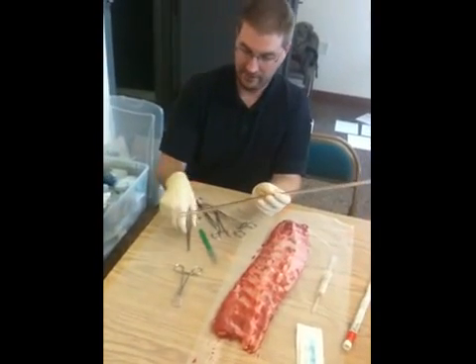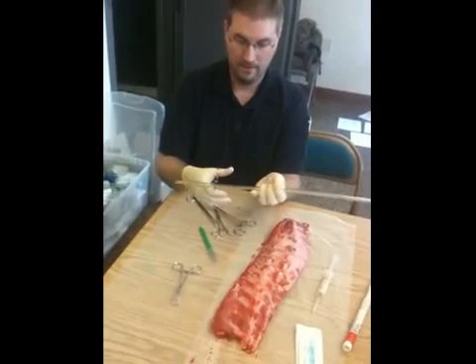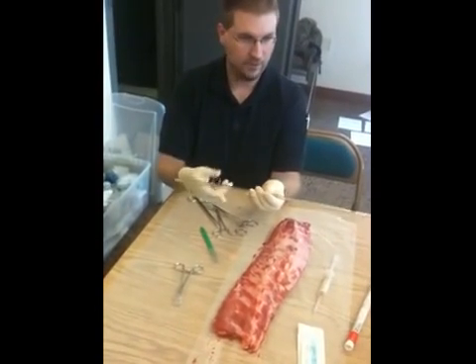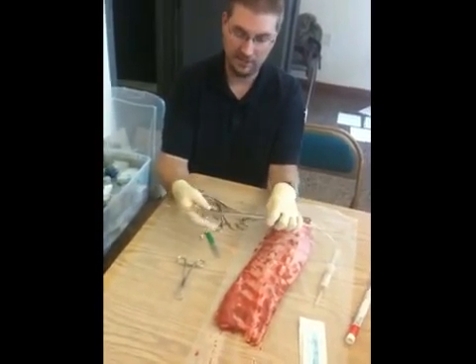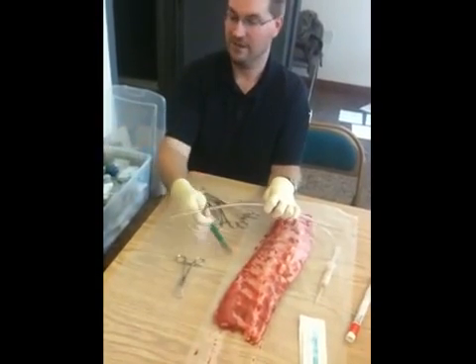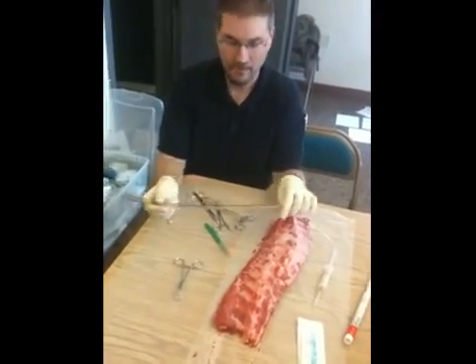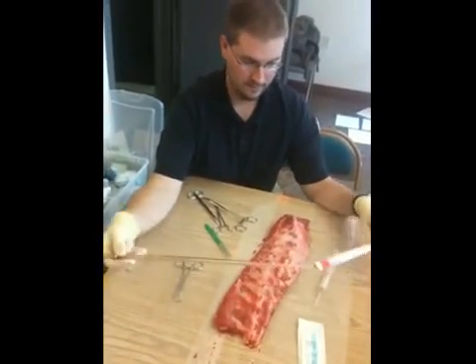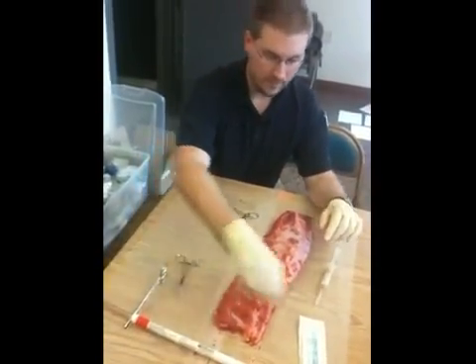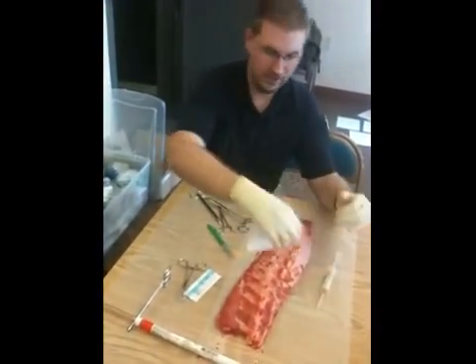What I like to do is preset everything up. You have a nice flat clamp here. What I like to do is put that on the chest tube first, because sometimes you get a lot of blood when you put that chest tube in — blood will kind of shoot out and spray everybody. So you go ahead and get all your stuff set up. With a suture, you can go ahead and introduce that onto your sterile field.